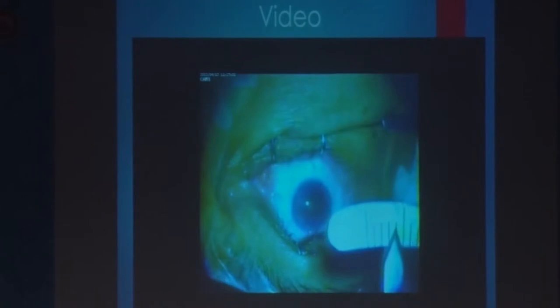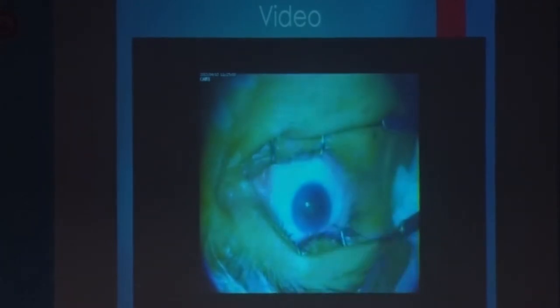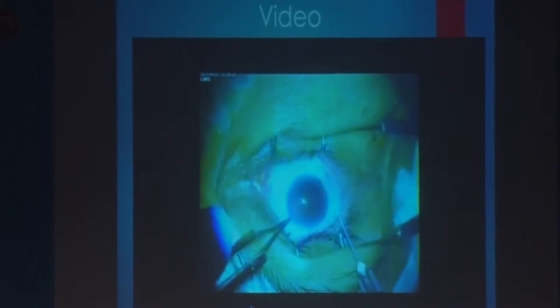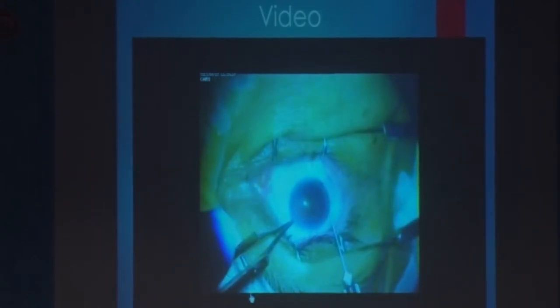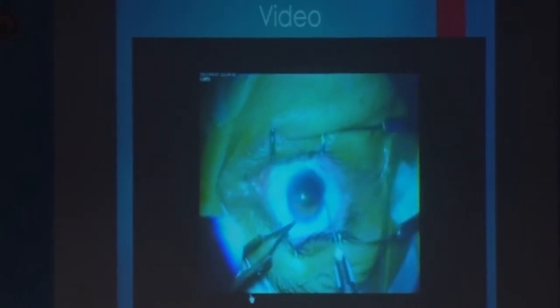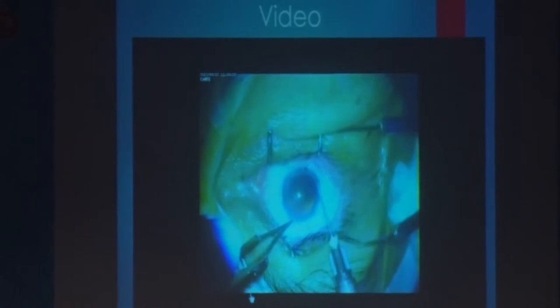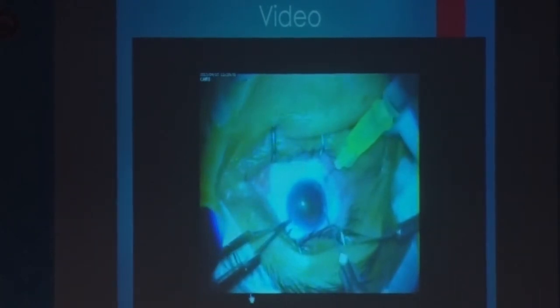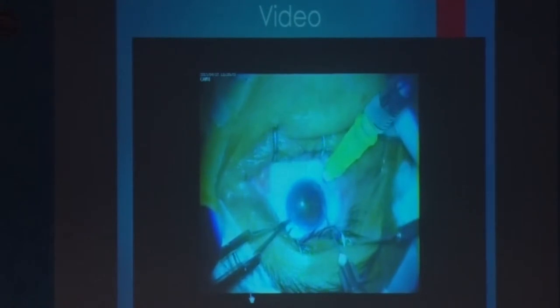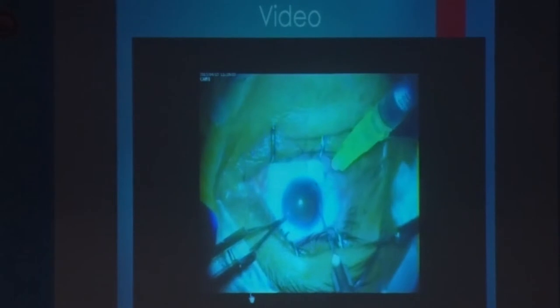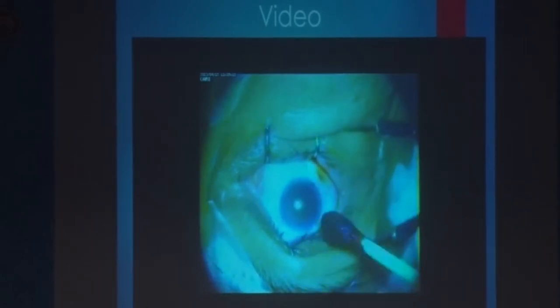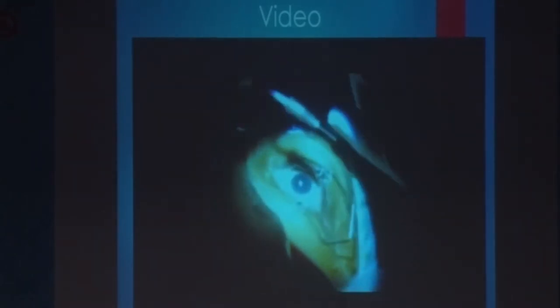A 26 or 30 gauge needle — any needle can be used. Before giving injection, just mark the injection site. This is the pre-injection paracentesis. I am going through the stromal lamellae, just entering inside the anterior chamber — not going deep inside, only the needle tip just inside the anterior chamber. Now the intravitreal injection is given. While giving the injection, aqueous egresses out through this pre-injection paracentesis, so there will be no bleb formation, no vitreous incarceration, and IOP rise will not occur.